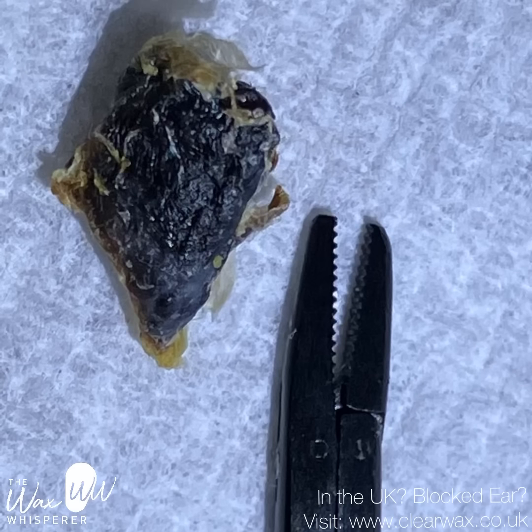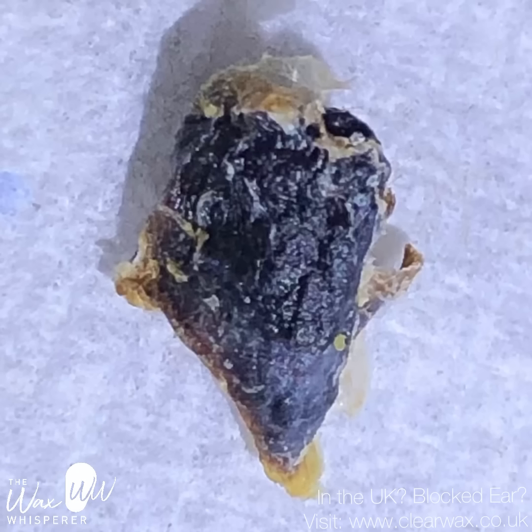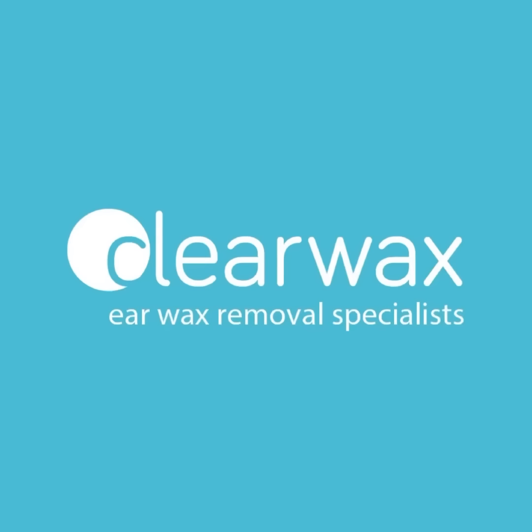If I attempted to remove that, it may just cause trauma. I would have to use some olive oil if I was going to remove that and then suction it. And I just don't want to use any oil, don't use any suction, don't need to. Again, in the close-up, you had the forceps beside the wax plug. You would have seen the jaws on the forceps as well. They're 5mm standard size jaw crocodile forceps.